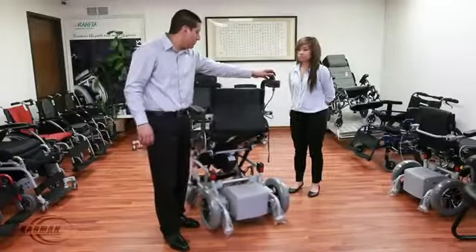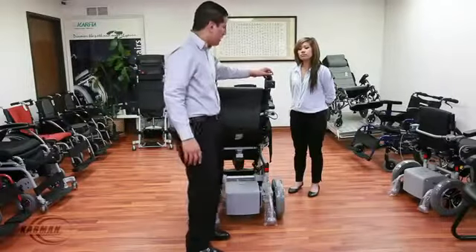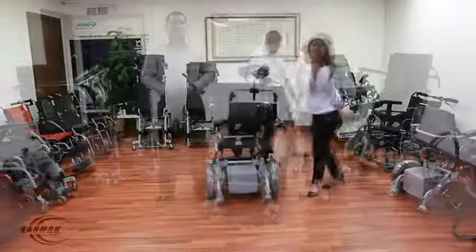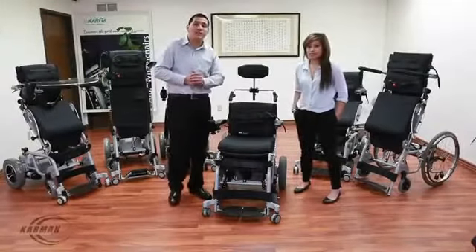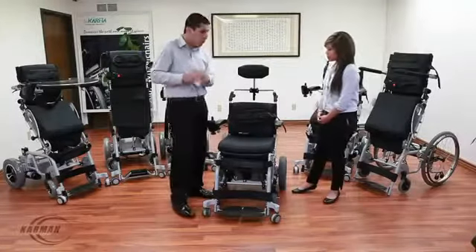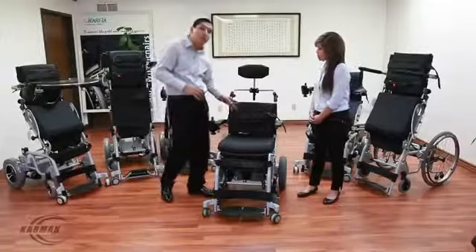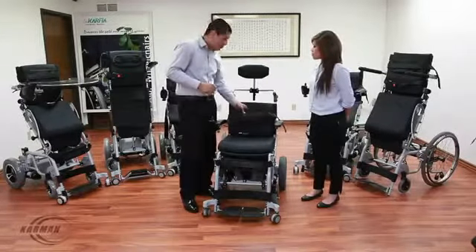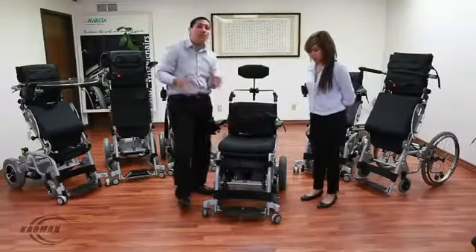This is our XO202 with the dual companion joystick, available in a 16-inch or 18-inch seat width. Now, this is our last model we're going to be demonstrating — the XO202. This is the original and still the best of our stand-up family of wheelchairs. Let's go over the adjustments you can order: you can order a higher back, raise or lower the backrest. Please refer to our order forms on our website and your local dealers for further adjustment questions. It comes standard with a chest strap, seat belt, and knee wedge. These also have flip-up and angle-adjustable foot plates.